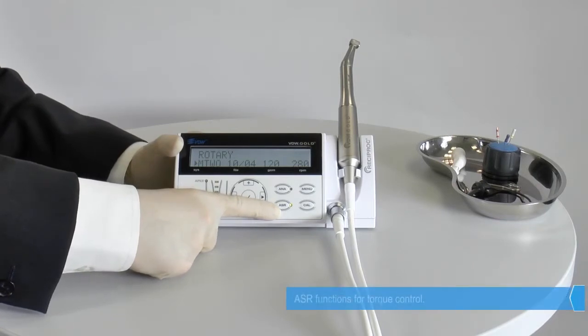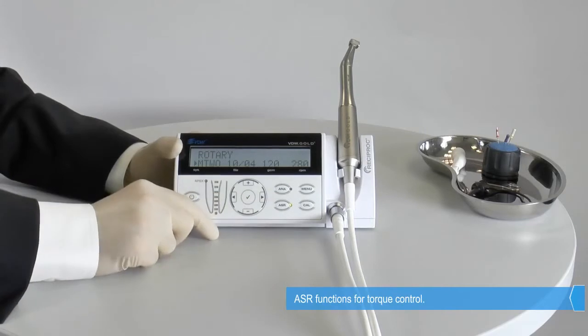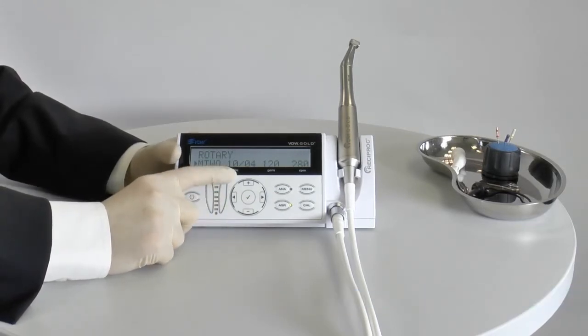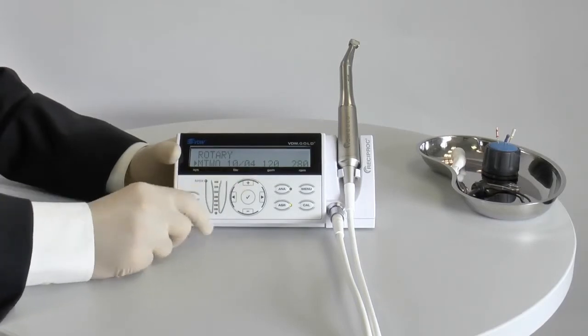Pressing the ASR key controls the autostop reverse function. When the ASR key lights green, the torque level for each file size is monitored.